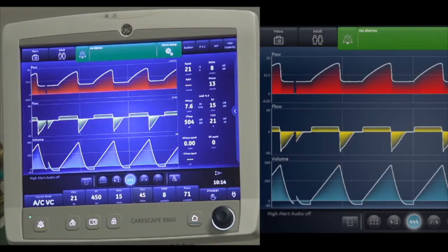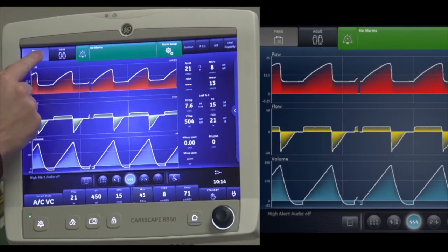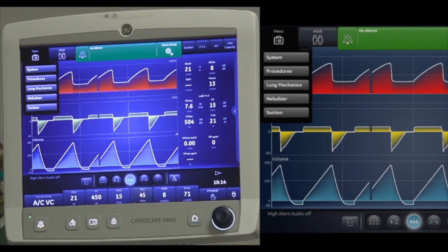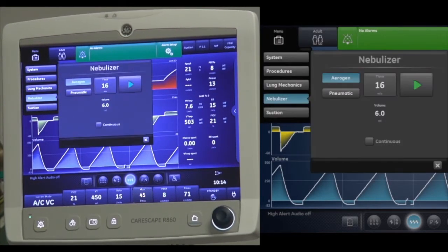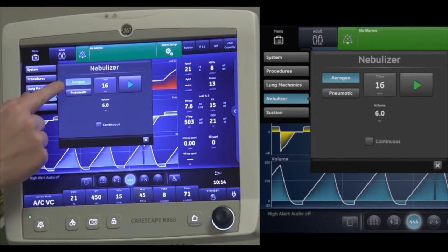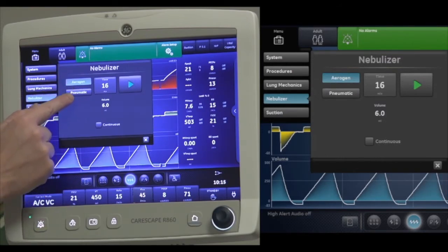To use the nebulizer function, touch the top left-hand corner of the touchscreen display. Select the nebulizer tab — this opens up the nebulizer menu. You have a choice between an Aerogen or Pneumatic nebulizer.